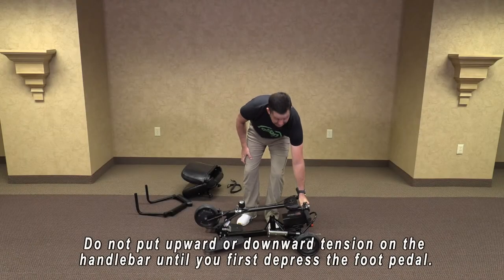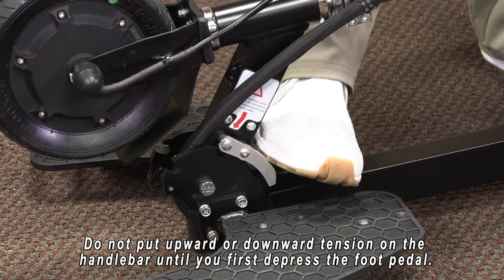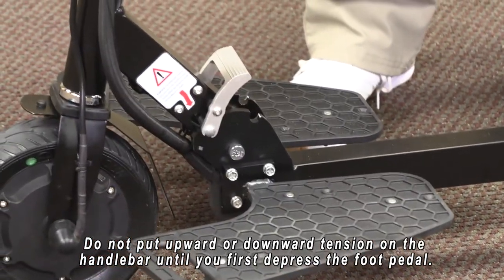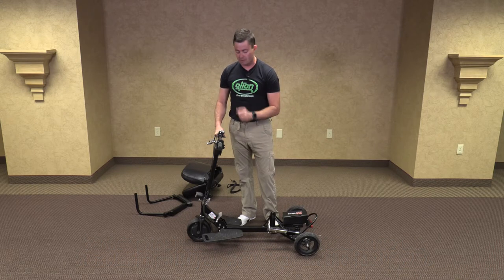You will hold the handlebar. This is only to make sure that it doesn't fall when you press the foot pedal. Press down the foot pedal, releasing it — it allows the handlebars to move up and snap into place. Be careful not to put too much tension or the foot pedal will not disengage.